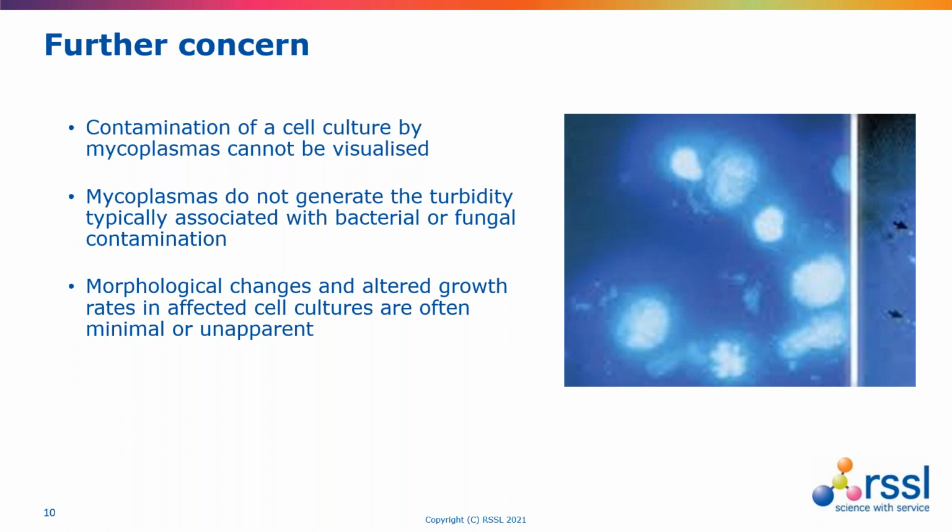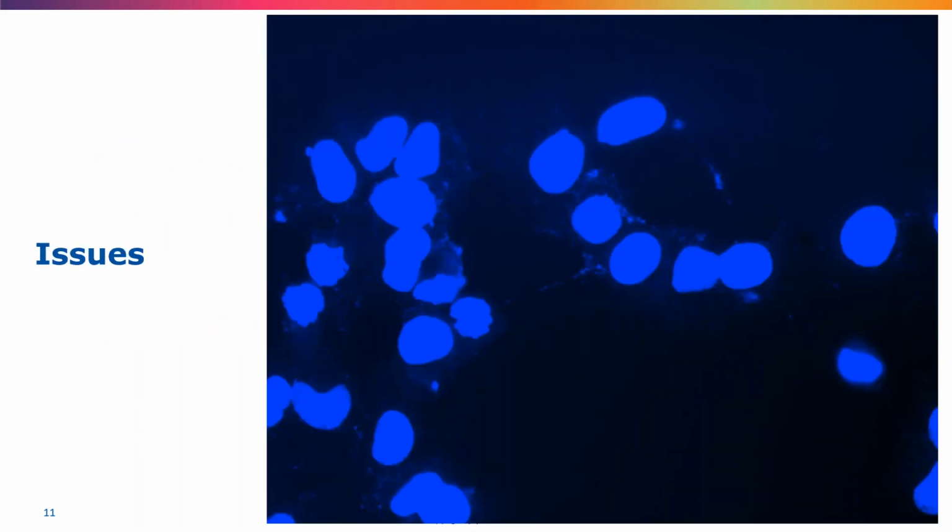And if you take a look at different figures, the proportion of cell cultures that are contaminated globally does vary. I guess it varies according to regulated versus non-regulated industries, and also to the degree of controls in place. But looking across several sources, the range appears to be between 15 and 35% of all continuous cell cultures worldwide are said to be contaminated.